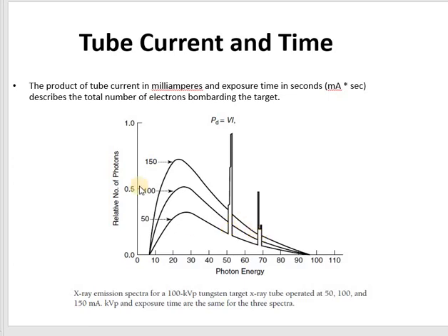We don't exchange any target, and this is unique to the kVp setting and the type of power supply, single phase or three phase. The only difference that you can see here is the current, and let's say we use it at different times and it generates different mAs. So the intensity differs with different tube current and time.